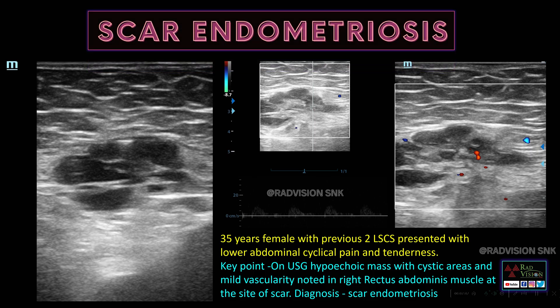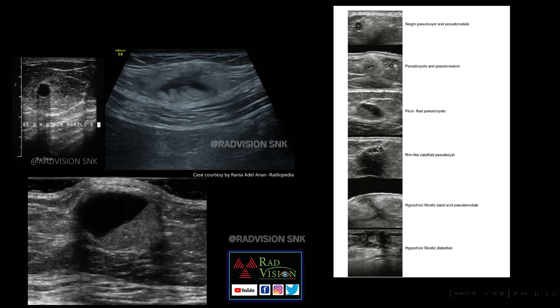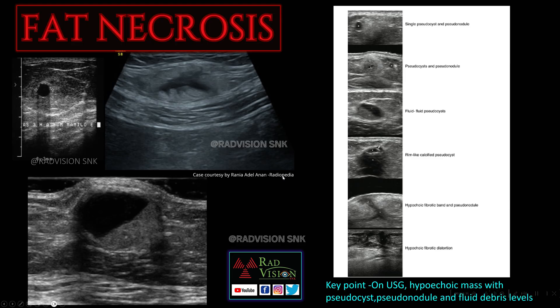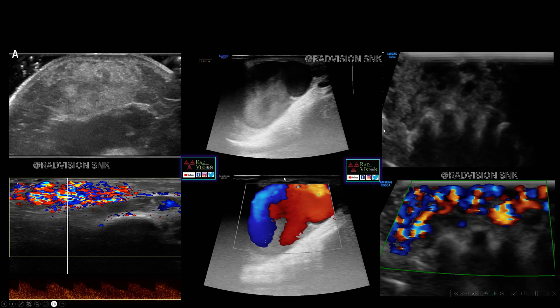Desmoid and scar endometriosis are common differentials for anterior abdominal wall masses, along with hematomas and others. In a trauma case, there is a hypoechoic lesion with central necrosis and pseudo-cyst or pseudo-nodule appearance. Whenever you see hypoechoic masses with pseudo-cyst formation, pseudo-nodule formation, fluid levels, or fluid-debris levels — one of the differentials is fat necrosis, especially in the setting of trauma.